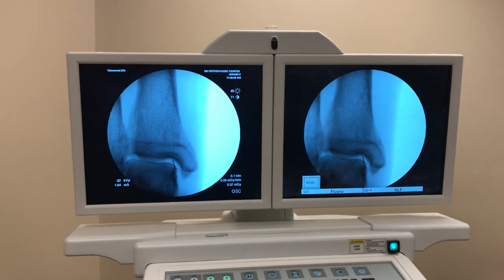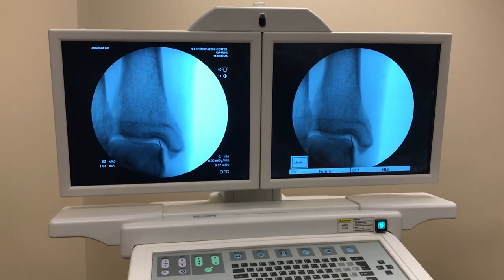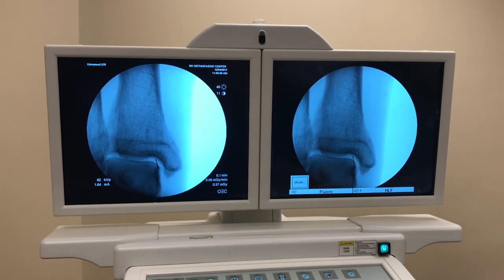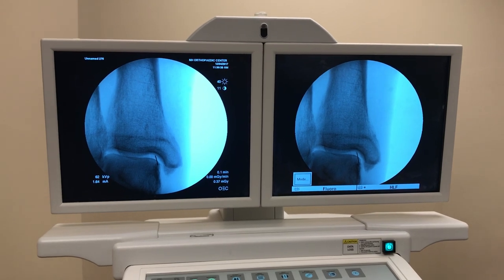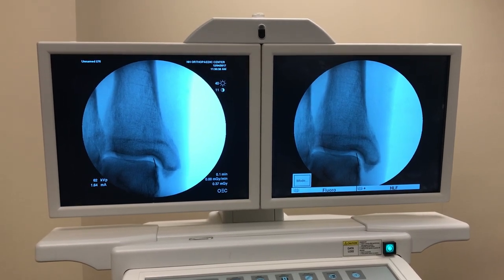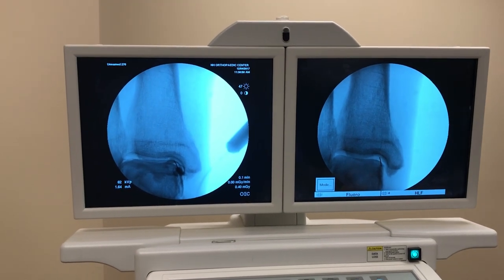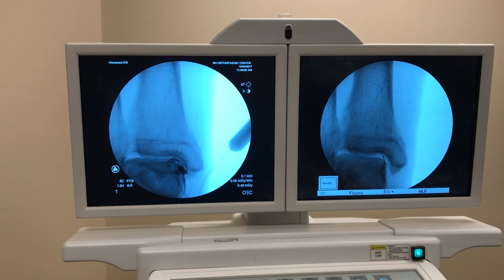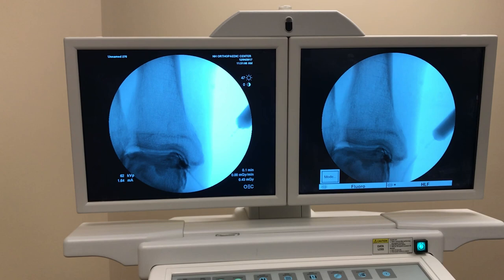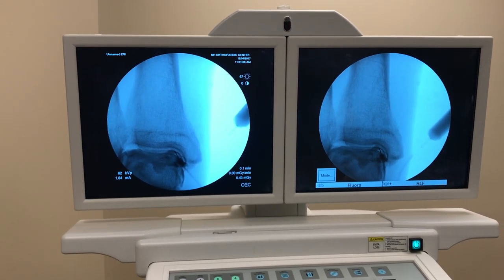Now I'm going to set up the dye, and we'll fill up the ankle joint. This is saline and Isovue contrast — you'll see. You can see a nice dye pattern across the joint. So now I know that I'm intra-articular. I can see my nice dye pattern of the joint.